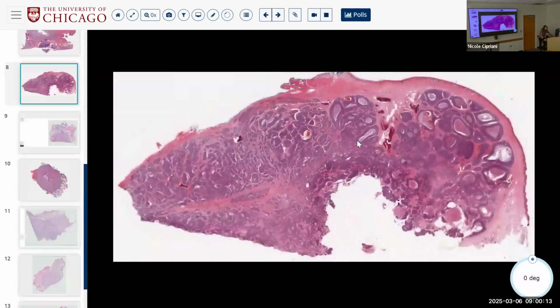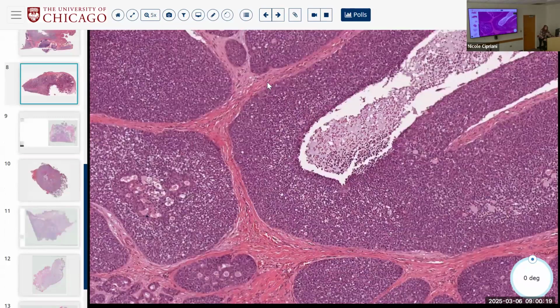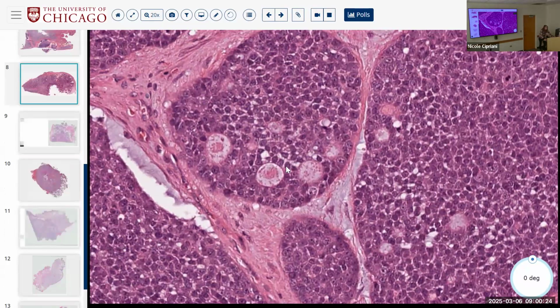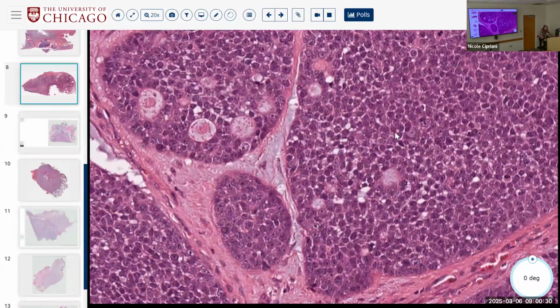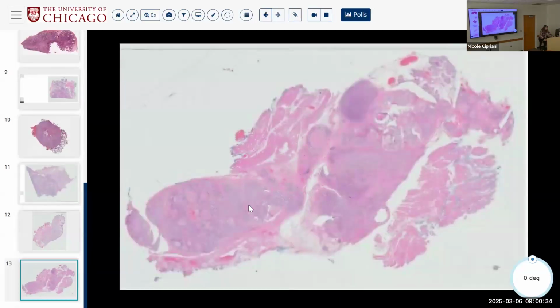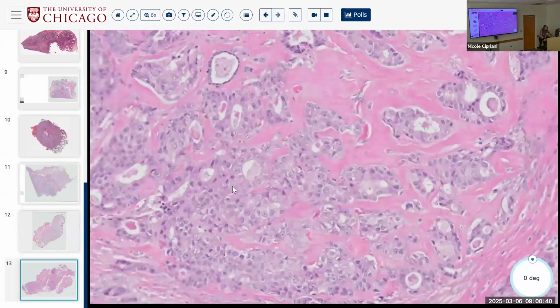Where was the, right here, right? So here is your super blue, super basaloid, solid, high-grade adenoid cystic. Not so much cytoplasm, no apocrine snouting here. Yes, you can have nucleoli because that's what you have in high-grade salivary carcinomas, but you are lacking that abundant eosinophilic apocrine cytoplasm. You're lacking the apocrine snouting, and you're lacking this kind of Roman bridging or Roman arching.